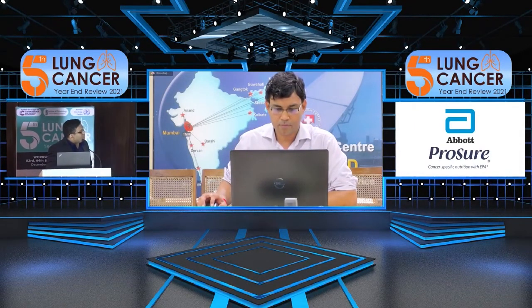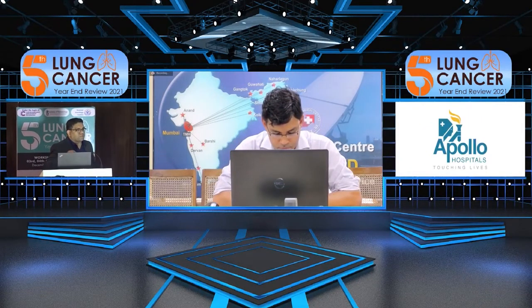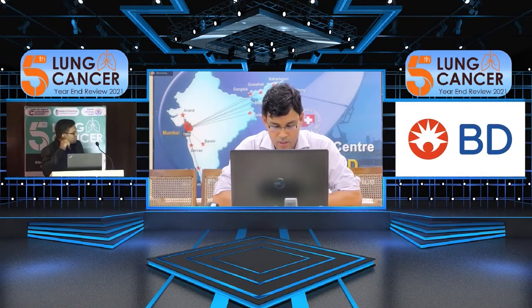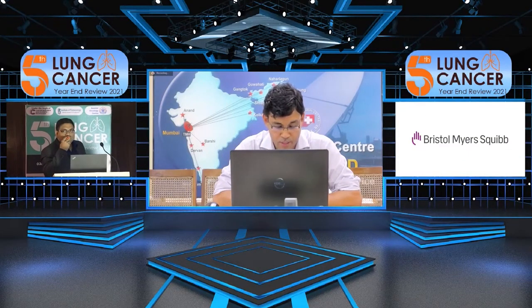So if you're looking for brain mets, is a specific Tesla required, and does a specific millimeter thickness need to be taken? So 1.5 Tesla is a good machine, and most centers will have 1.5 Tesla.